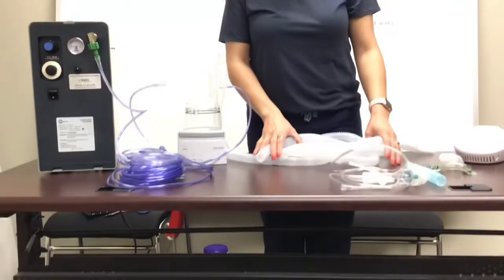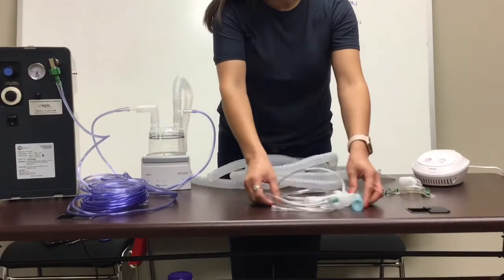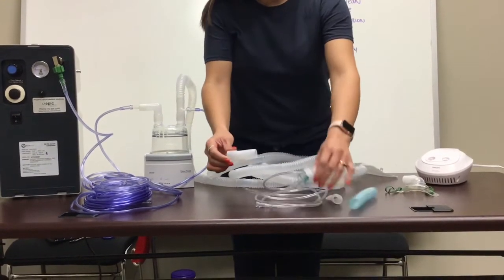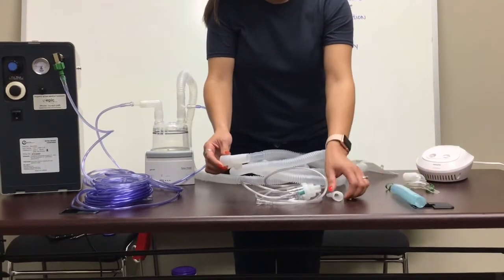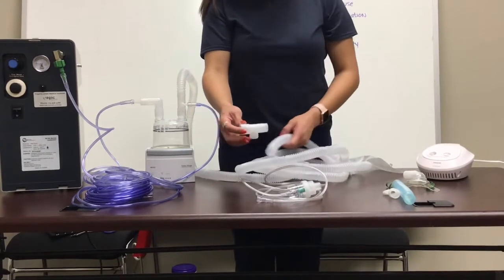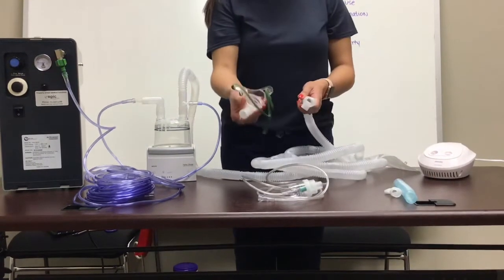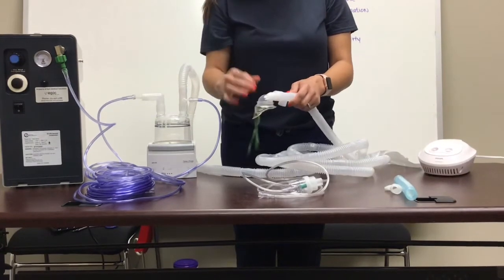If nebulizer treatments are needed to be given to your patient, you will be needing your nebulizer kit that we will also be providing you. In your nebulizer kit, you will only be needing your T adapter, your neb cup, and your nebulizer tubing. Your spacer tubing and your mouthpiece will not be needed. You will connect your T adapter on the end of your corrugated tubing, and you will get your trach mask and attach your trach mask to the other end.